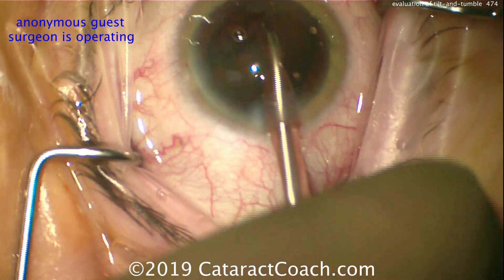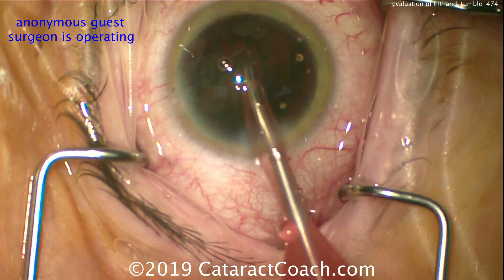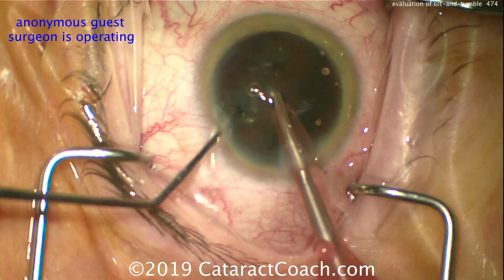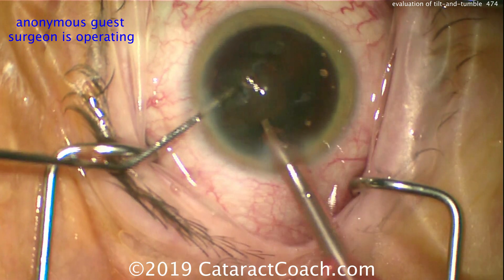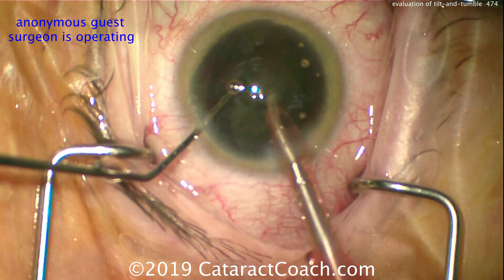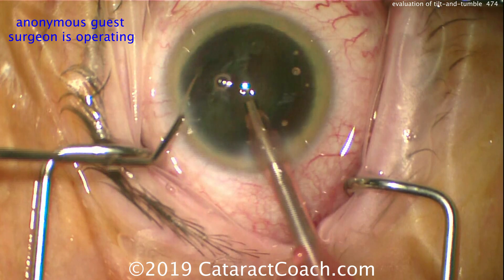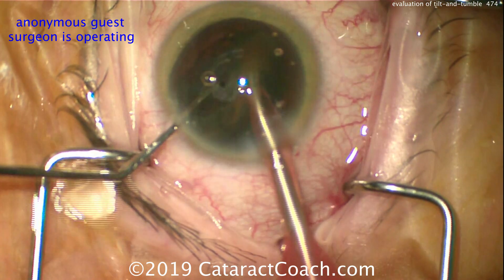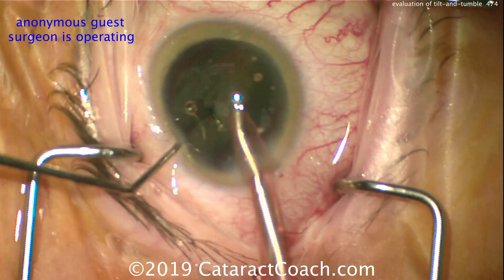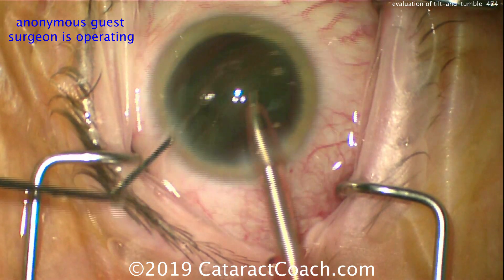Here's the FACO tip going back in the eye. Looks like some additional tetracaine was put on the eye during that little break. Let's get that chopper in the eye — here we go. Adjust that speculum — that's another very important piece. Look how the chopper keeps hitting the speculum; we want to avoid that situation. Switch to a different speculum. You know why I use my design speculum, which sits nasally since I operate temporally most often. You want to change the speculum or its position, or the position of your incisions, in order to avoid hitting it — because that's really not ideal.